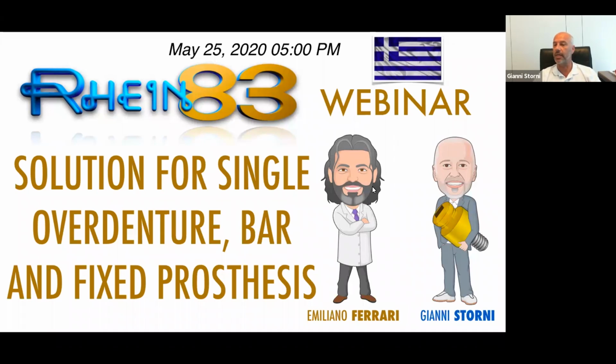So we will start to see what you can do using our solution. We will see a standard prosthetic project and also one new solution, that is the fixed solution. Okay, so another use of our Equator.